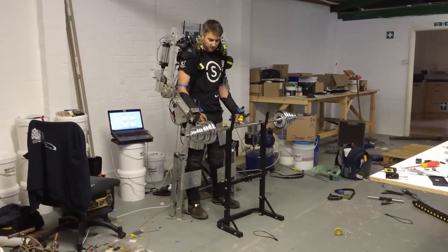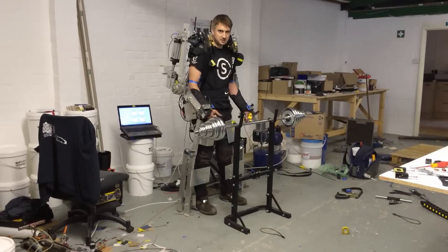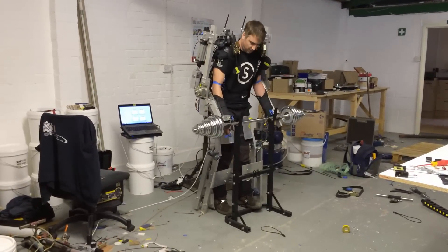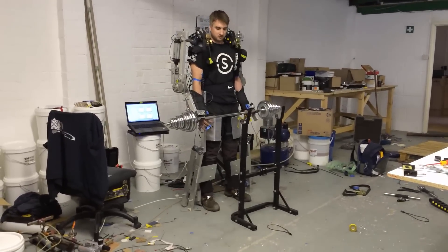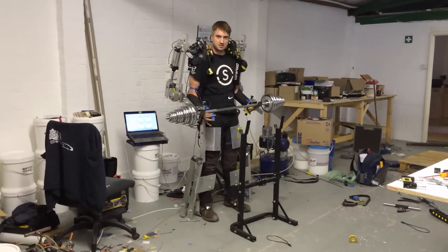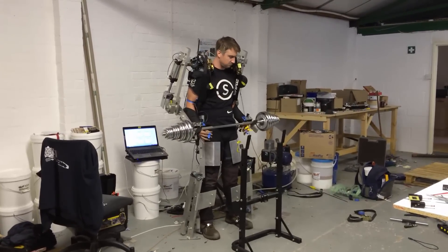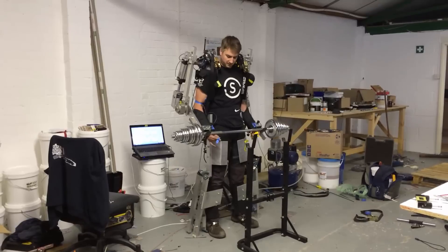We just have 50 kilograms here and we're going to bicep curl it a couple of times. When I straighten out, the entire weight goes straight through to the ground. We should be able to go up nicely, push it a bit more, and then hold it. Until ready, we can go back down.